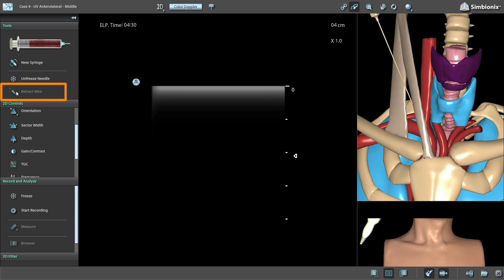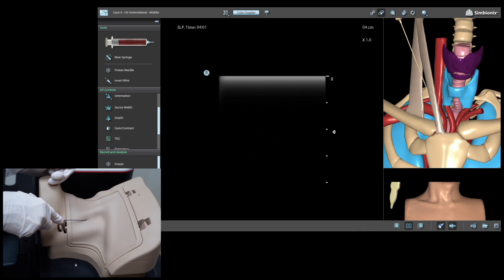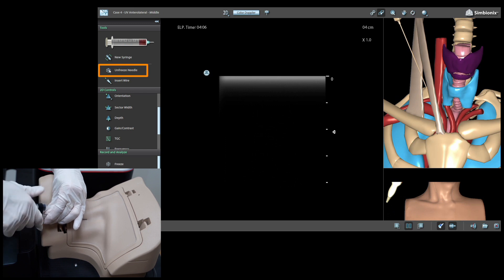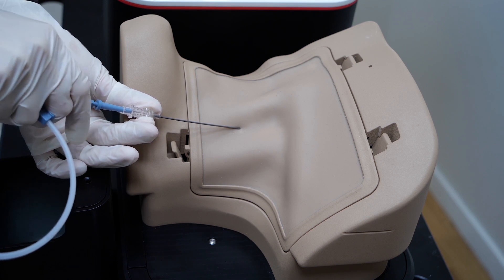A virtual wire will be inserted into the vein. Training can also include full, hands-on practice using a real guide wire and catheter if desired. Just press the needle freeze button, unplug the syringe with the needle tracking sensor, and insert a guide wire.